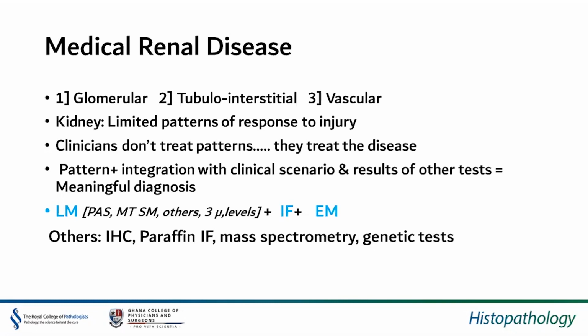Therefore, in order to get a meaningful diagnosis in the kidney biopsy interpretation, one needs to be able to recognize the pattern and integrate the findings with the clinical scenario and results of other tests. This gives a meaningful diagnosis, which gives a sense of direction to the clinician regarding the management.